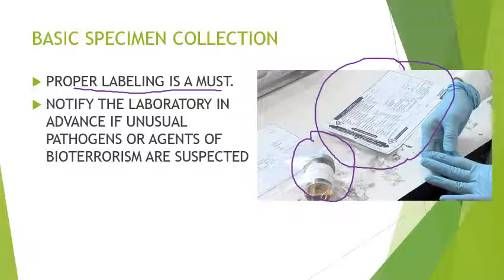Note, if there are unusual pathogens or agents of bioterrorism, you need to notify the laboratory in advance. And if there is a positive result, for example positive for Bacillus anthracis or a panic value in bacteria, you need to verify it and tell the doctor.